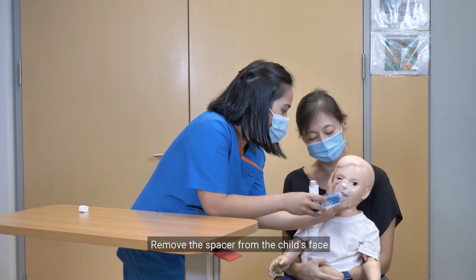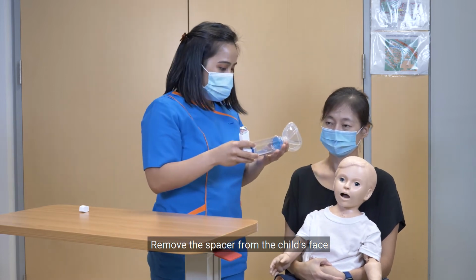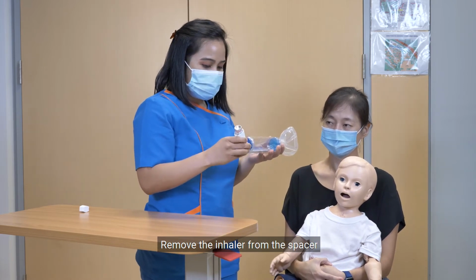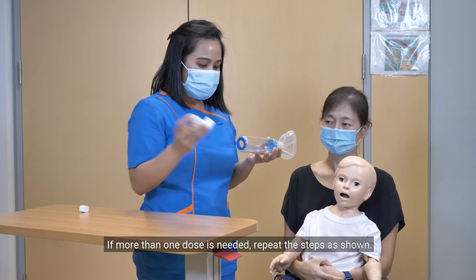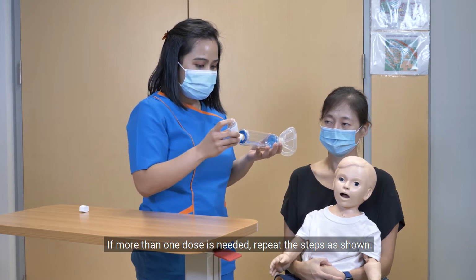Then, remove the spacer from the child's face. Remove the inhaler from the spacer. If more than one dose is needed, repeat the steps as shown.